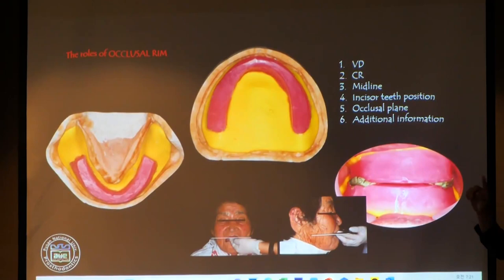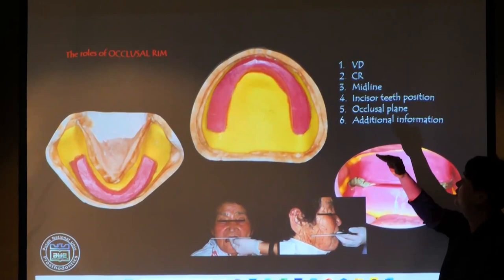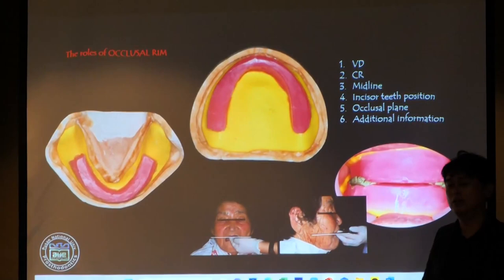Okay, memorize one more time. The occlusal rim has 6 kinds of things: vertical dimension, central relation. This sequence is very important. Midline, and then the location of the incisor teeth, and the occlusal plane. If you have the ability, you can mark additional information on the occlusal rim.